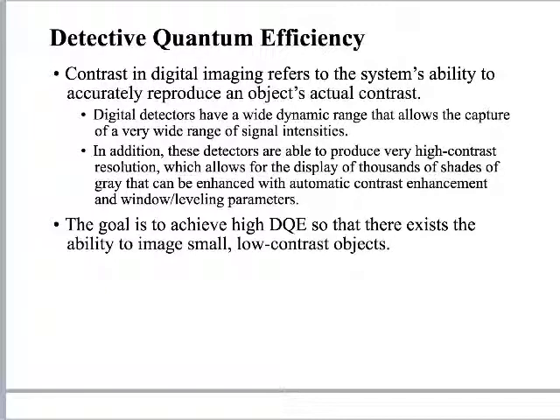They have different attenuation values. And it's helpful to be able to differentiate between the outside part of the kidney and the interior portion. They're very, very close to each other, so they have a low contrast between them. But can we create a system that can see between the two of them and tell the difference between the two of them? That would be the way to improve on digital systems.